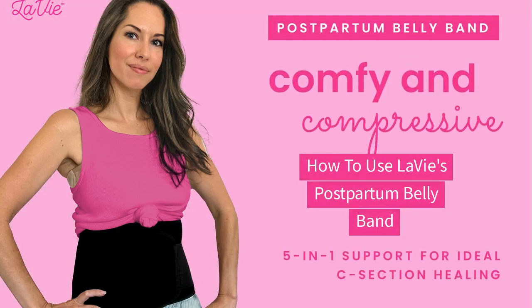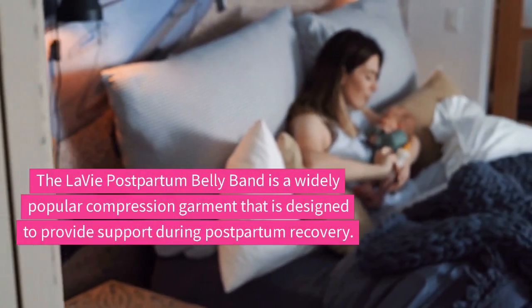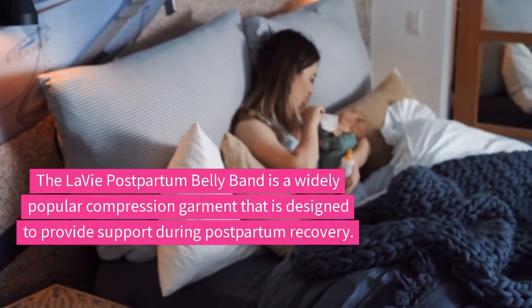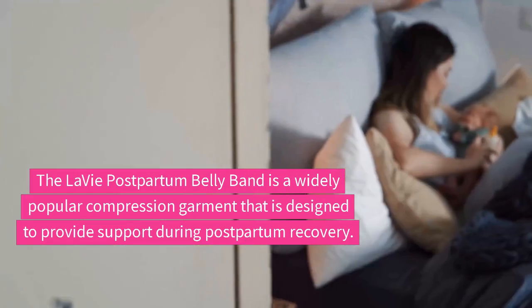How to use the LaVie Postpartum Belly Band, offering 5-in-1 support, ideal for C-section healing. The LaVie Postpartum Belly Band is a widely popular compression garment that's designed to provide support during postpartum recovery.